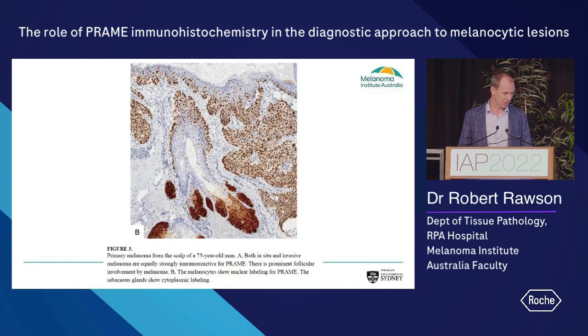But the vast majority of cases in the paper that Klaus published were like this, strong diffuse staining in both the in situ and the associated invasive melanoma.